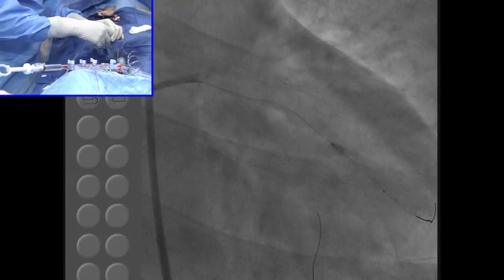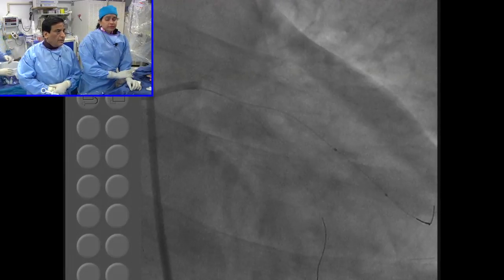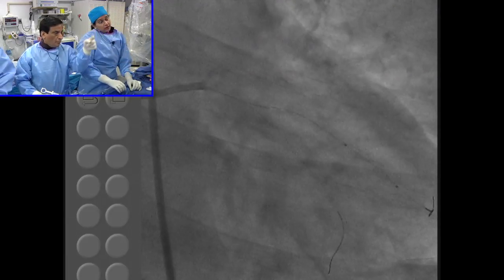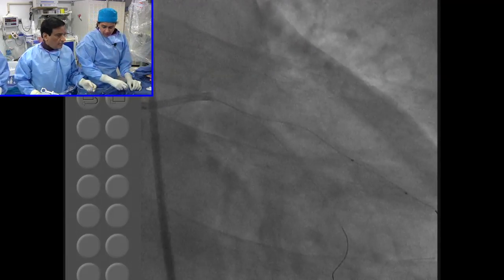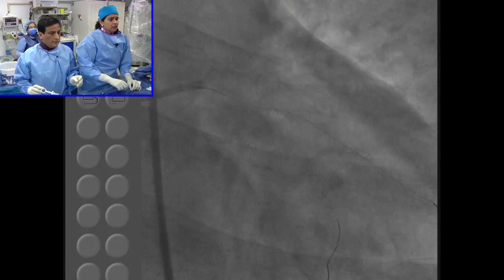That one, because the point is we put a mini crush, one stent distally and one in the OM. Bigger, longer stent in the OM. Right? If you have to do that, 20 is too long there. No, but from proximal to that area. No, I think 10 would have been better. Yeah, we are 10. Give the 10. Good. Let's take a picture.